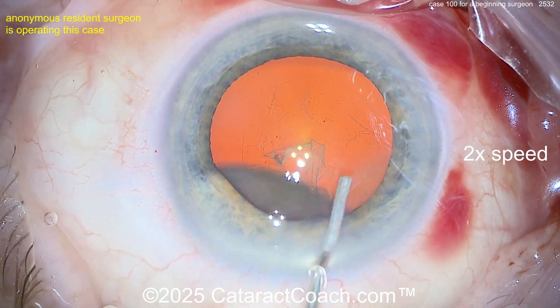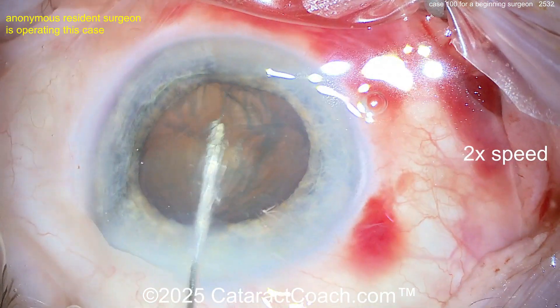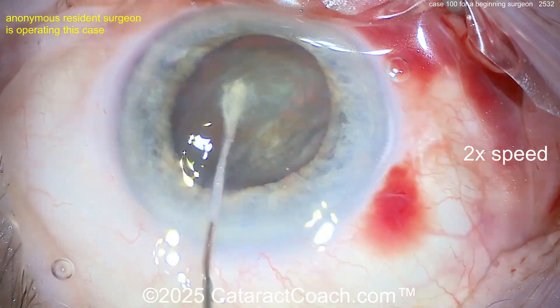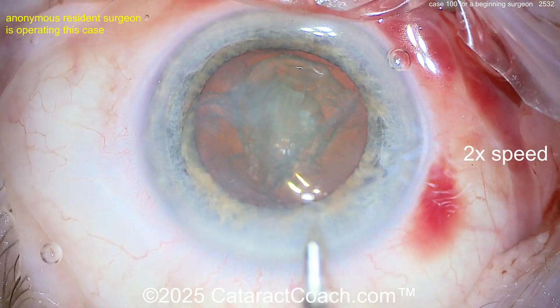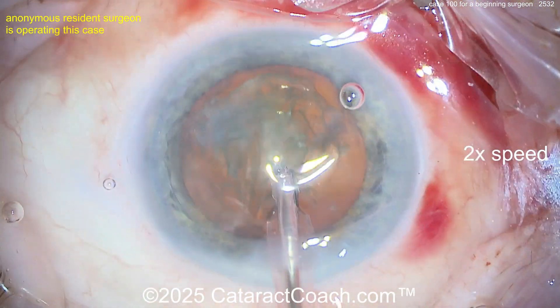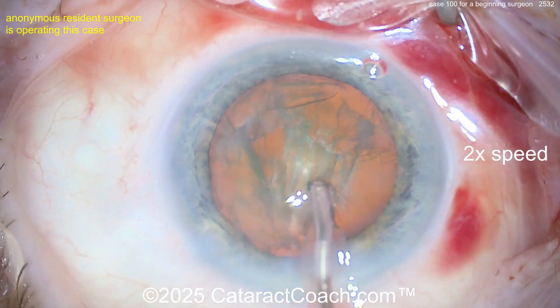The rhexis is complete, pretty well centered. Now hydrodissection with a flat cannula — the nucleus came right out, but you put it back in the bag. I would have liked the nucleus out of the bag. It's a little rough here — see the cornea is all wrinkly. You'll see those same wrinkles, Descemet folds, tomorrow morning because of that. Don't do that. Now here comes the phaco probe going inside the eye — cleaning up some anterior cortical material.